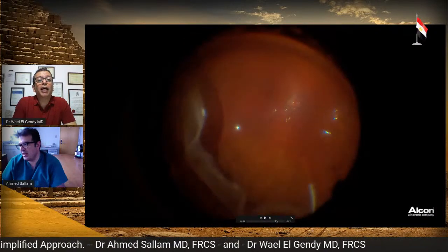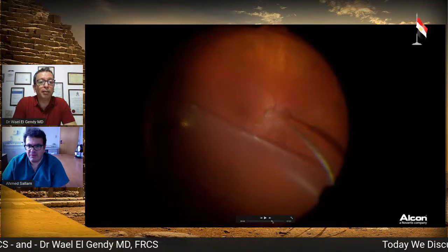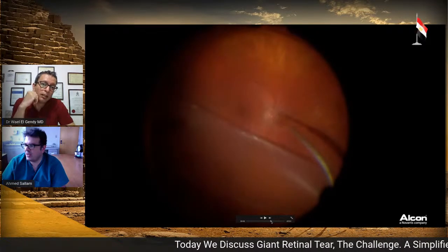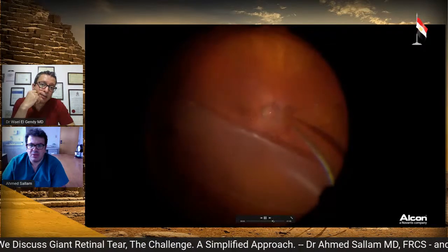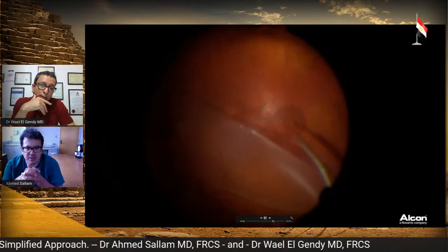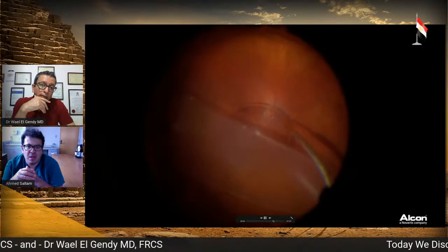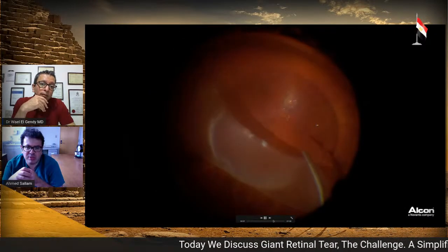So the next challenge. Do you have any other videos? I have a video here with a giant break, and now this is a difficult one. It's a detachment and the rolled edge, and it's the same concept really. So you inject over the disc. Initially, find a few bubbles, then they coalesce, and now you just go into the bubble and follow the bubble, and just do it slowly.